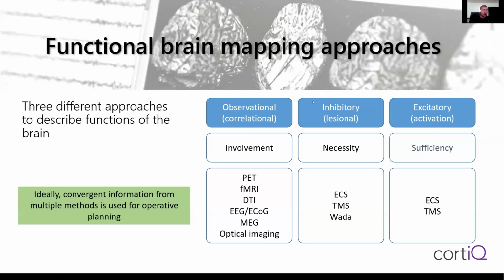So when we see which parts of the brain, when stimulated, are blocking a task or a body function, then we will see which parts are necessary to preserve during a surgery. This is very important, and that's why the electrical stimulation is also the gold standard for functional mapping, for example, for intraoperative decision making.